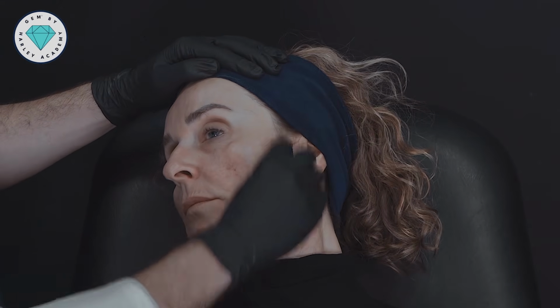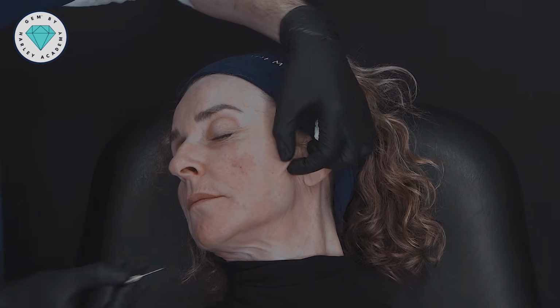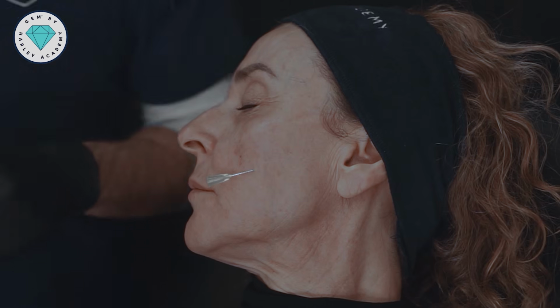Okay, so now the next thing we're going to do is treat this lateral midface in the subcutaneous fat. Again, using a 22 gauge cannula. And for this one, I'm going to do an entire syringe of filler to replace lost volume in the subcutaneous depth. So this entry point is now facing horizontally, and again, just into layer 2.